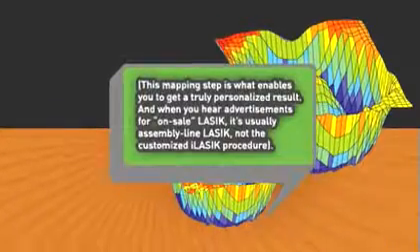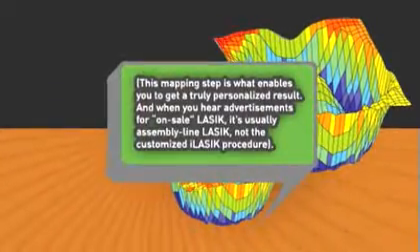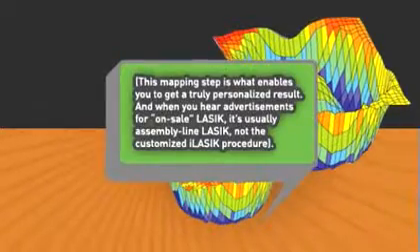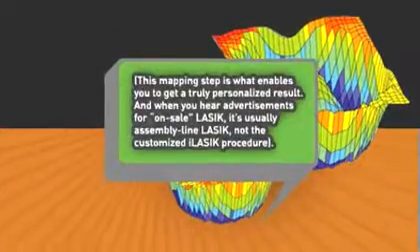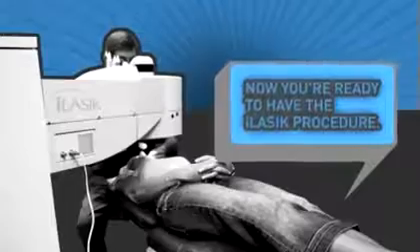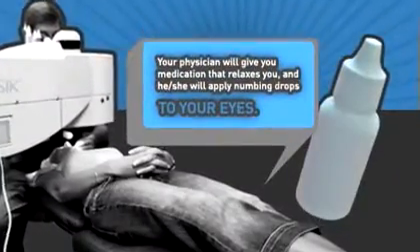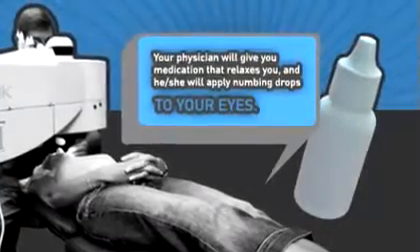And when you hear advertisements for on-sale LASIK, it's usually assembly line LASIK, not the customized iLASIK procedure. Now you're ready to have the iLASIK procedure. Your physician will give you medication that relaxes you and he or she will apply numbing drops to your eyes.